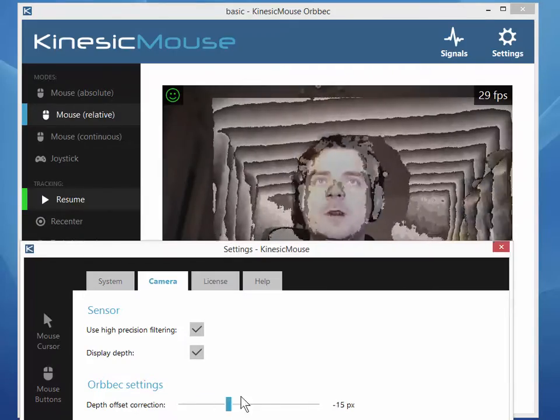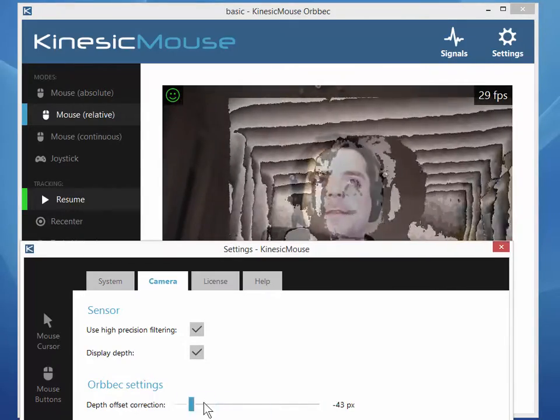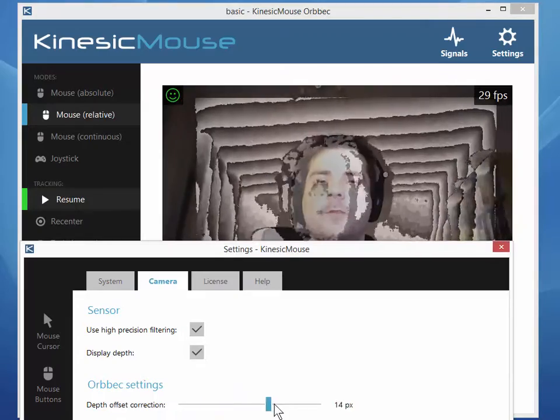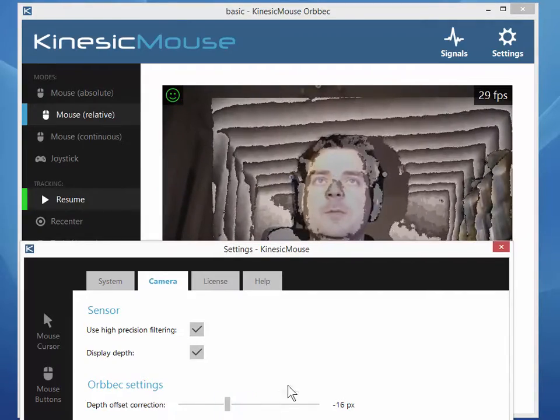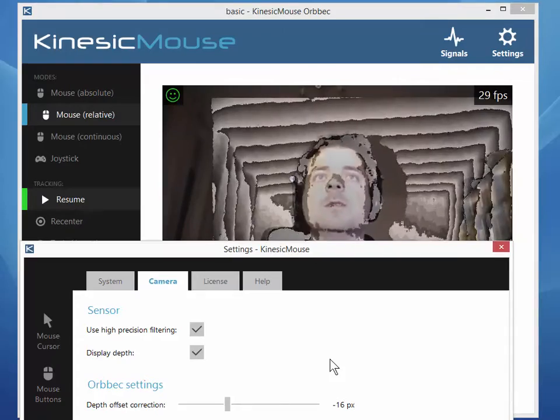As you can see, when I drag this slider, the depth frame is actually moving. You have to correct this offset so that it perfectly aligns with the color frame.